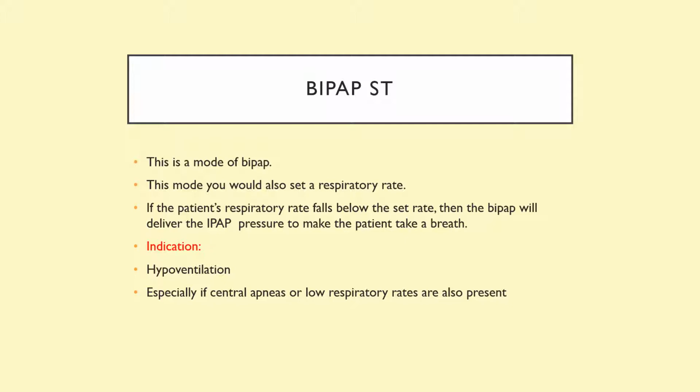The indication for BiPAP is hypoventilation, and BiPAP ST is especially indicated if the patient's having central apneas along with hypoventilation, or they're having very low respiratory rates. That might occur with someone who is using opiates and causing their respiratory rate to decrease during sleep.